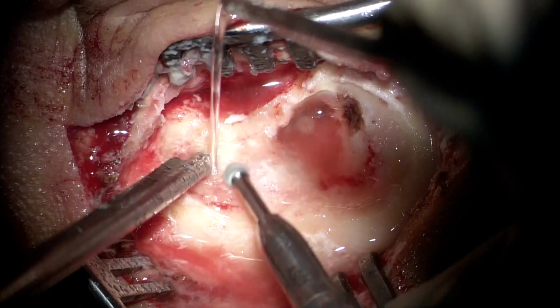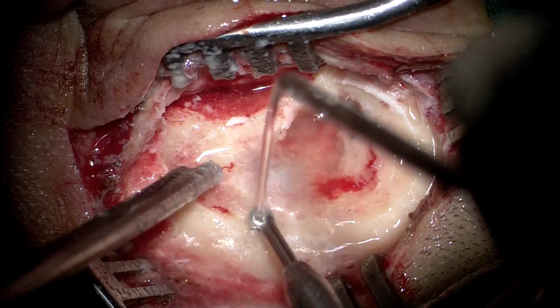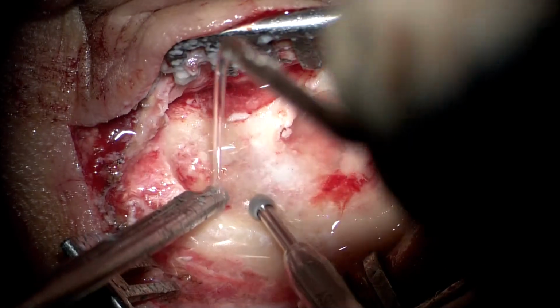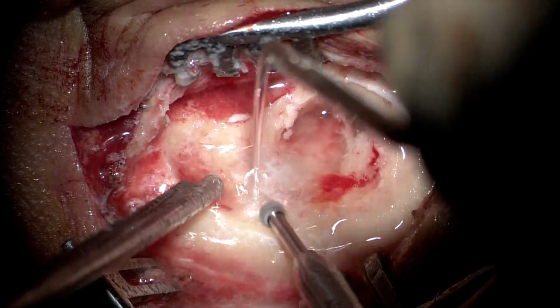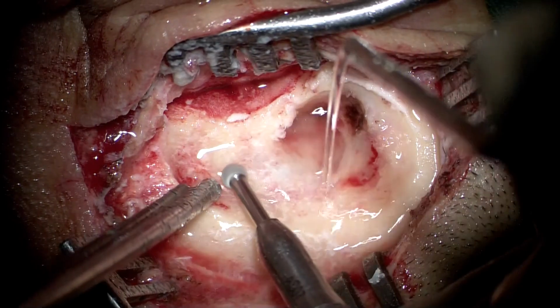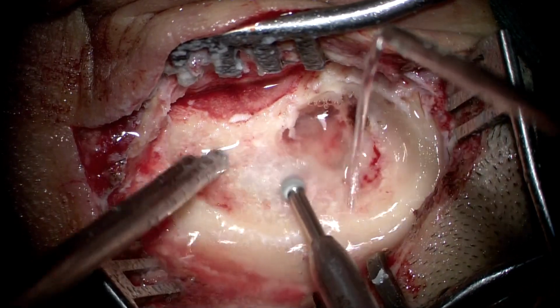do in a mastoid. So to be able to do that comfortably and avoid any complications such as bleeding, hemorrhage, or damage to the critical intracranial structures such as the sigmoid sinus and the middle fossa dura, we must have an adequate exposure. For that purpose, we would need to drill totally expose not only the sigmoid sinus but much more bone behind, inferior and superior to the sigmoid sinus, as well as the tegmen fossa dura, dural plate, and most importantly the sinodural angle.